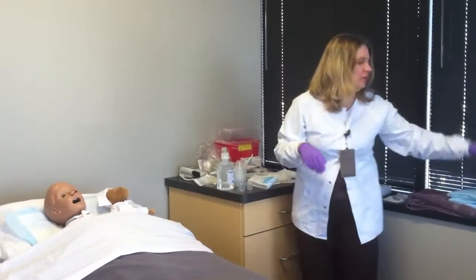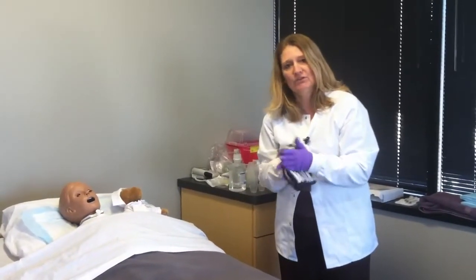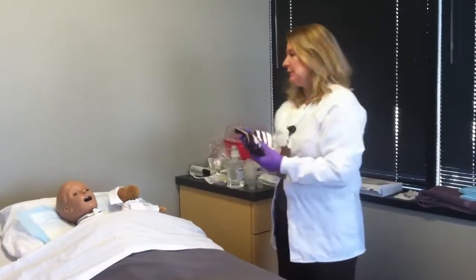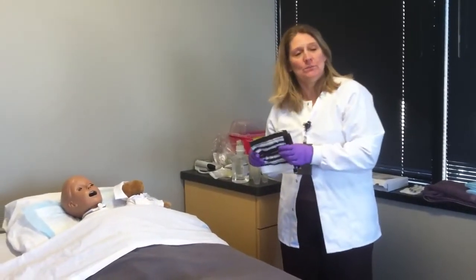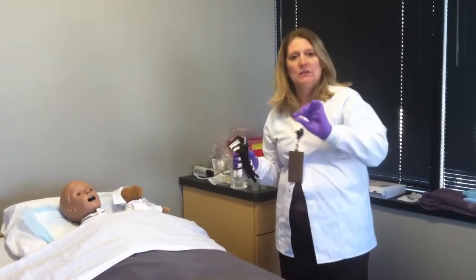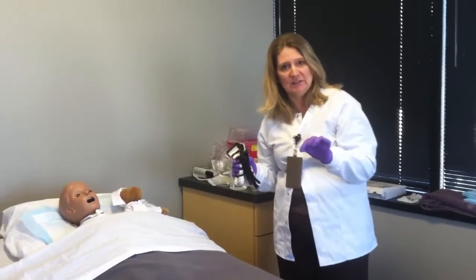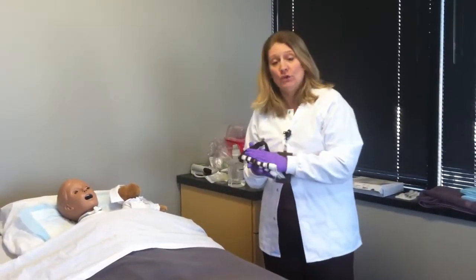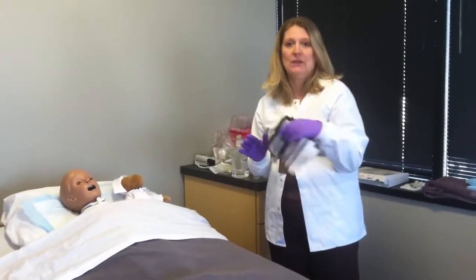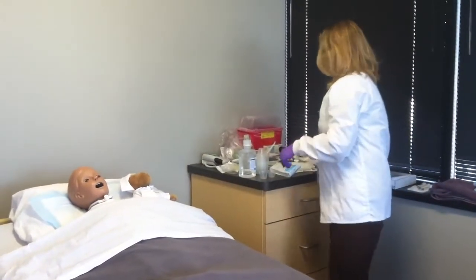This has been pre-moistened with just water, but I'm going to have a washcloth here too. And I want you to practice both types. You use the Q-tip for G-tubes that are new, I would say less than a month old, because with a Q-tip, you can be really gentle with that fragile skin that's still healing. If it's an older, well-healed G-tube site, then you'd use a washcloth and just wash around that stoma. So I'm going to show you both ways.